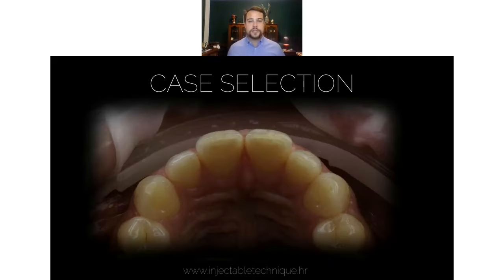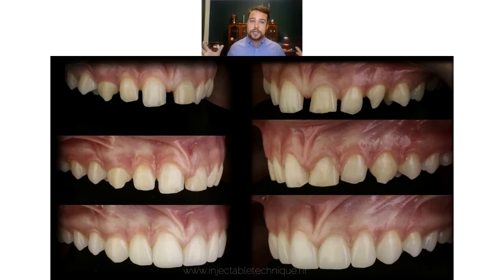Retroclined position of the teeth is perfectly indicated, because we just need to add some space. Multiple diastemas, of course, but in some cases we need to go for pre-prosthetic ortho. Here we have before, after ortho, and final result. Okay, so sometimes you need to go for pre-prosthetic ortho, or if the teeth are already too big or too protruded, it's not indicated.